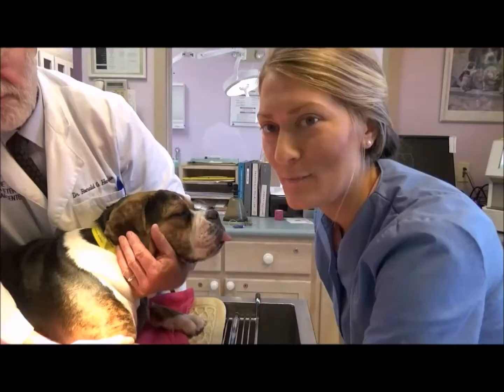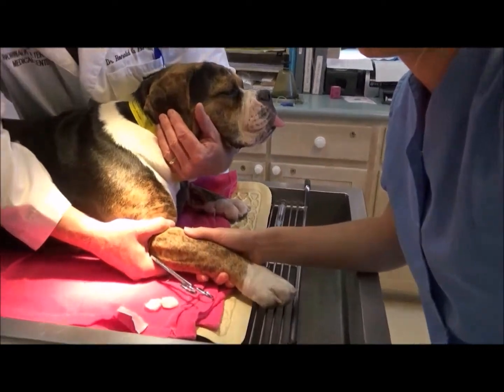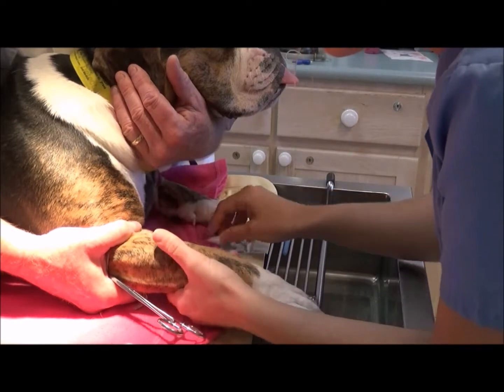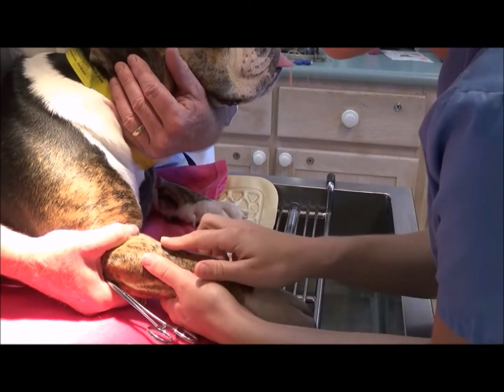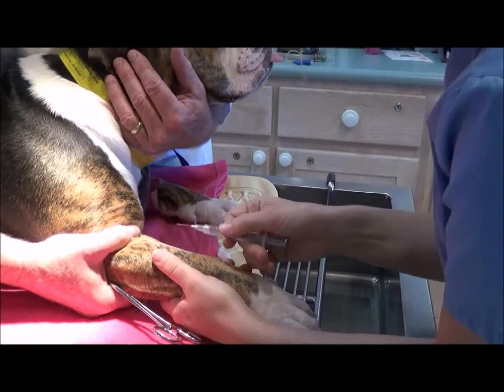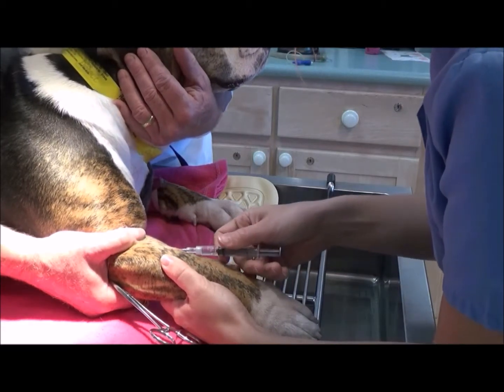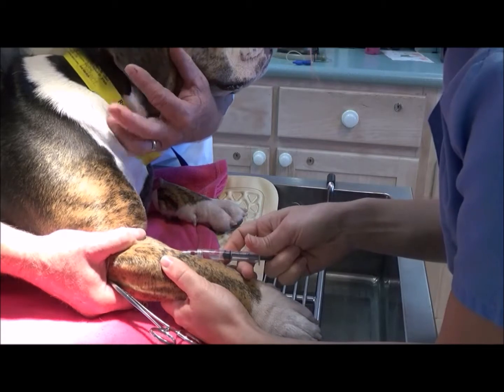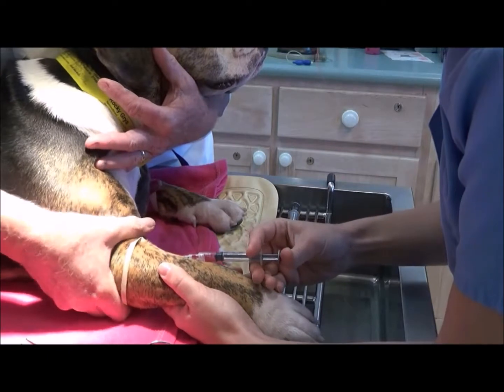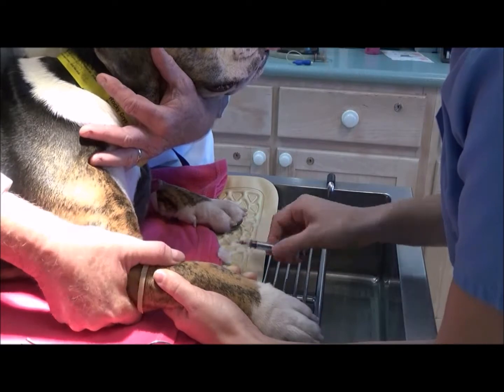All done. I'm going to give an IV injection of saline. So I place the tourniquet on the leg. I'm just going to cleanse the area with some alcohol. So I'll aspirate it first to make sure I'm in the vein, which I am. Then we'll remove the tourniquet, and now I'm good to go ahead and give the rest of the injection. Thank you. And we're good.